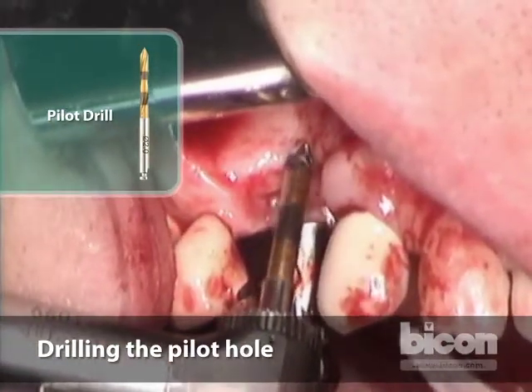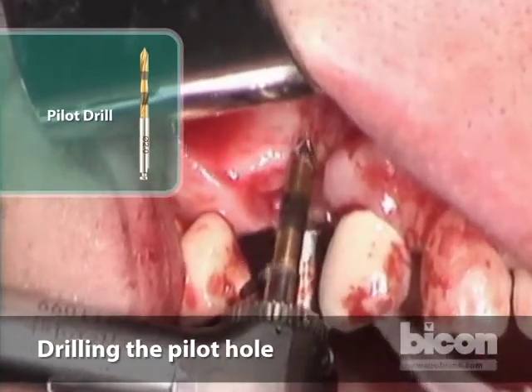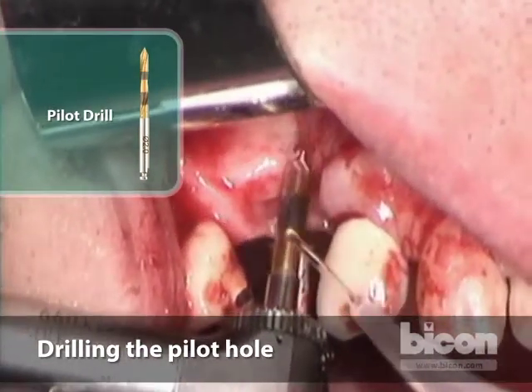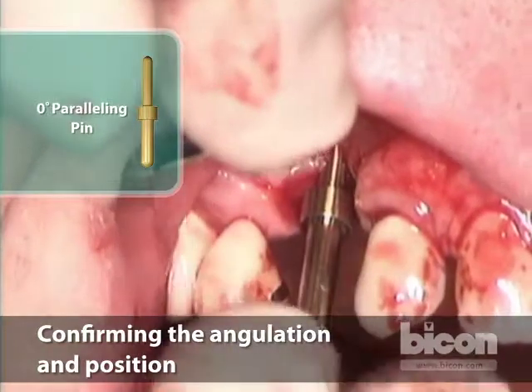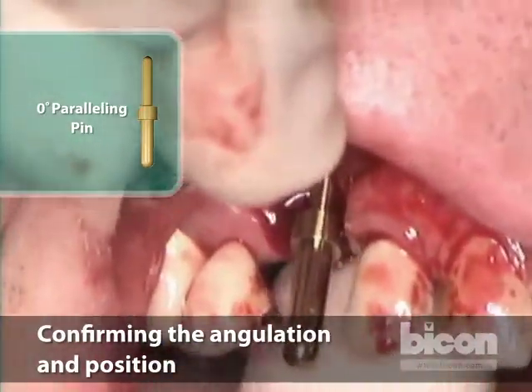Now it's at 8 millimeters. And we're going to go a little bit below 8 only because we can, and with the Bicon implant's tolerance, we can go 2 or 3 millimeters below the crest. Let's use another retraction. Okay, now we can see that the angulation is a lot better.